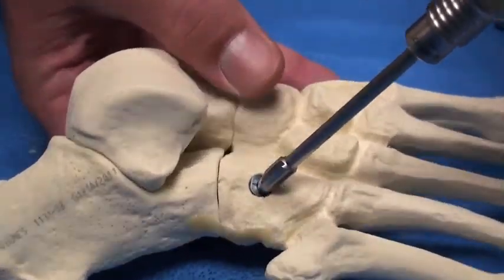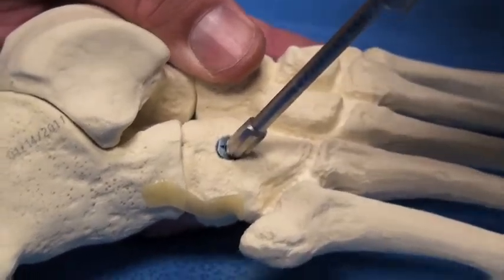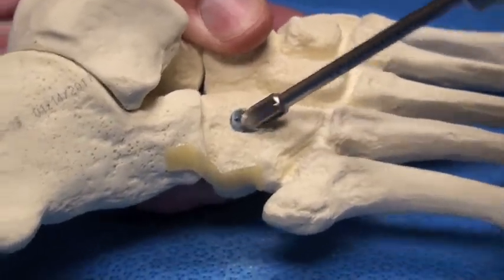Similar to a standard countersink, insert the bullet point into the alfix implant. Begin rotating and drop your hand down into the bone, thus creating a clearance for your inner frag screw.